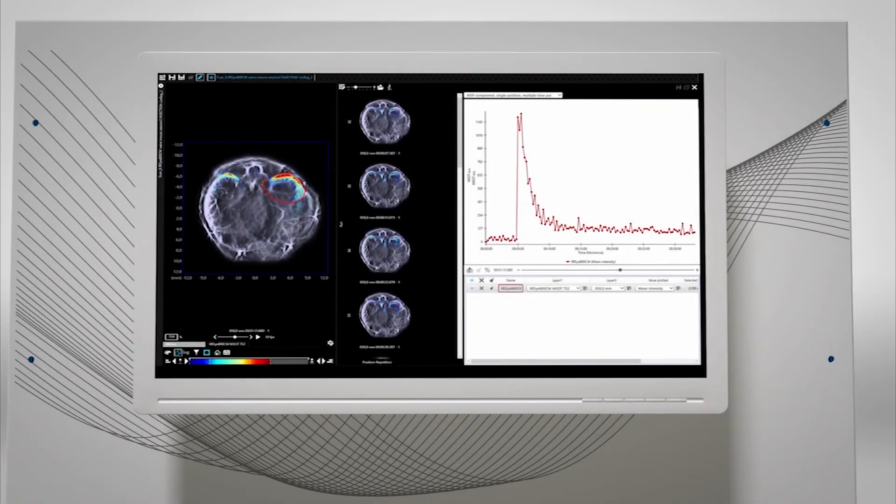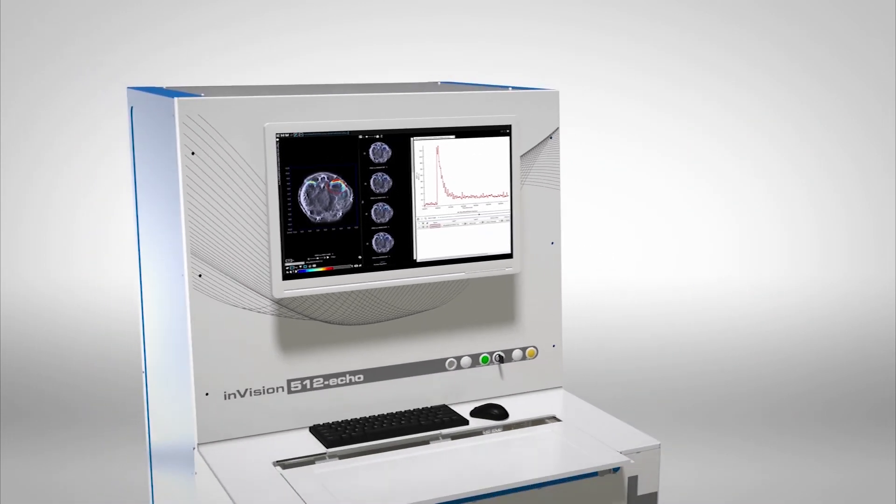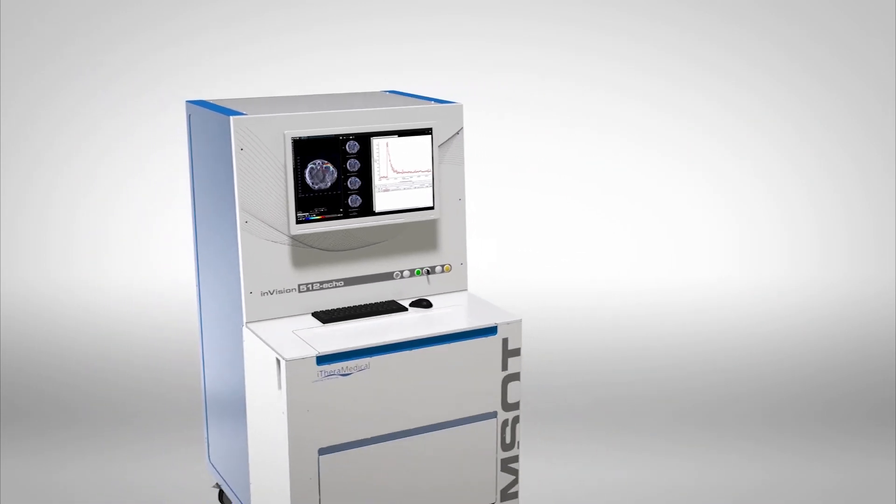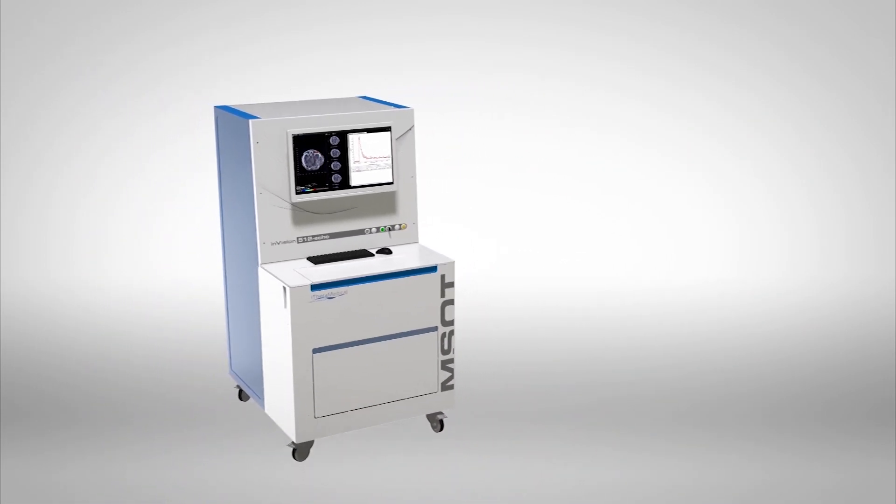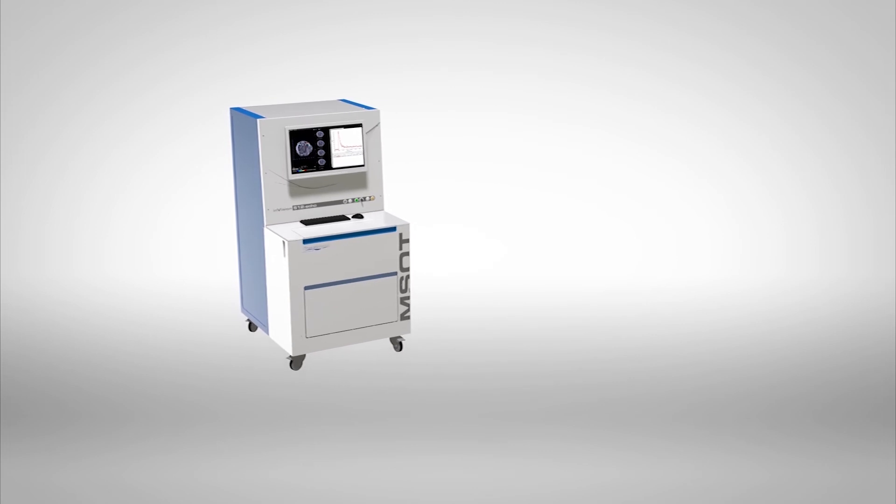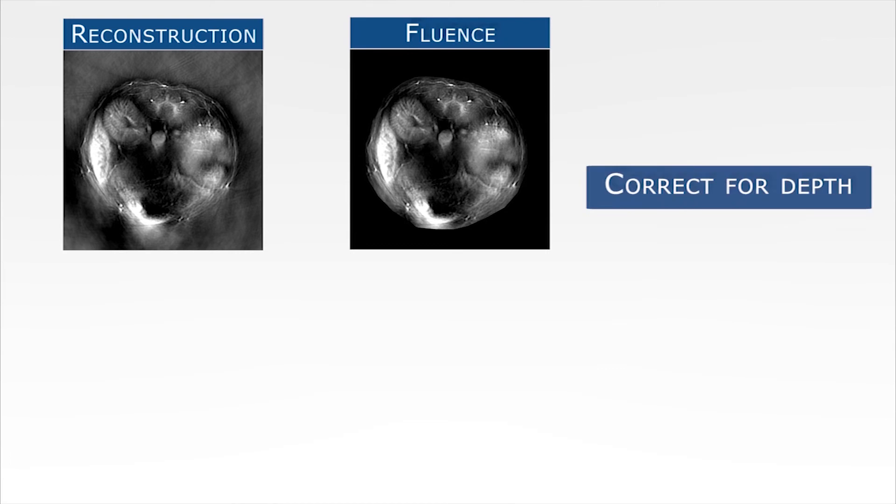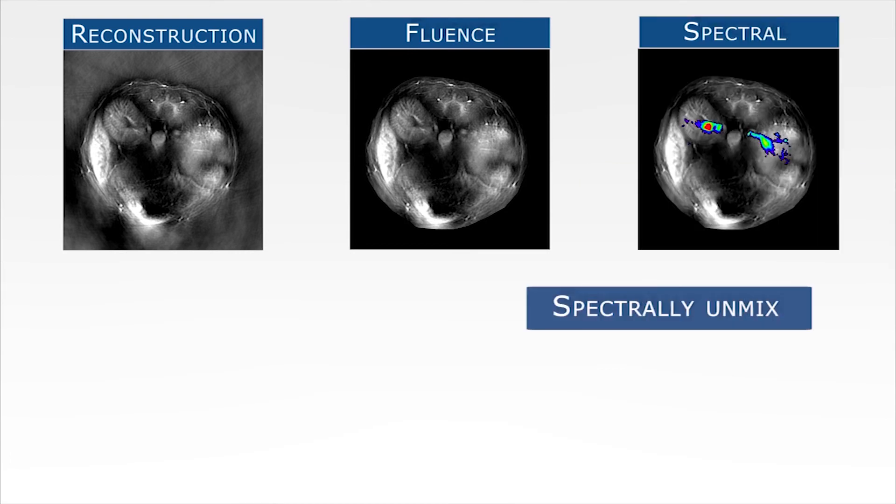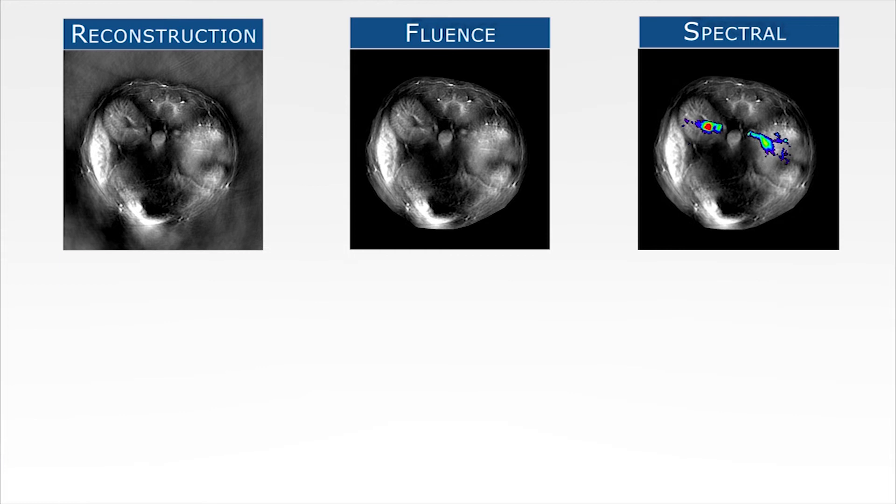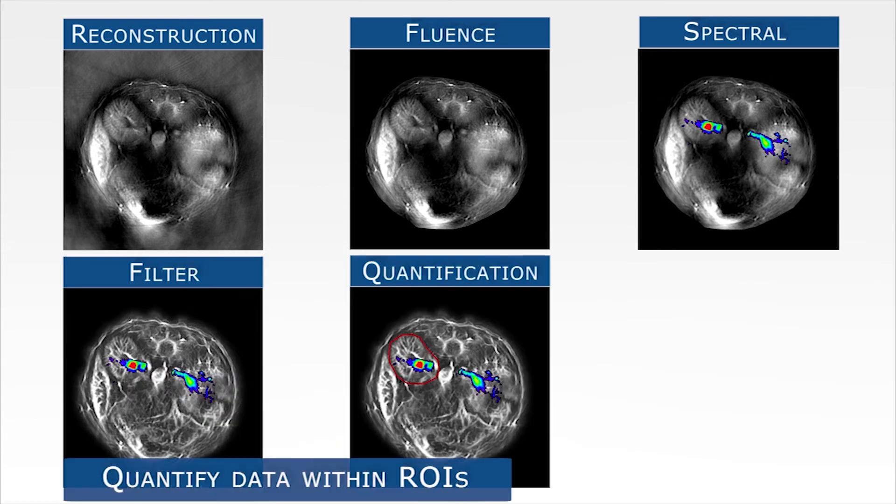This concludes the workflow of data post-processing in View MSOT. In summary, acquired data is first reconstructed to form images, followed by fluence correction, spectral unmixing, image filtering, quantitative analysis, and visualization.